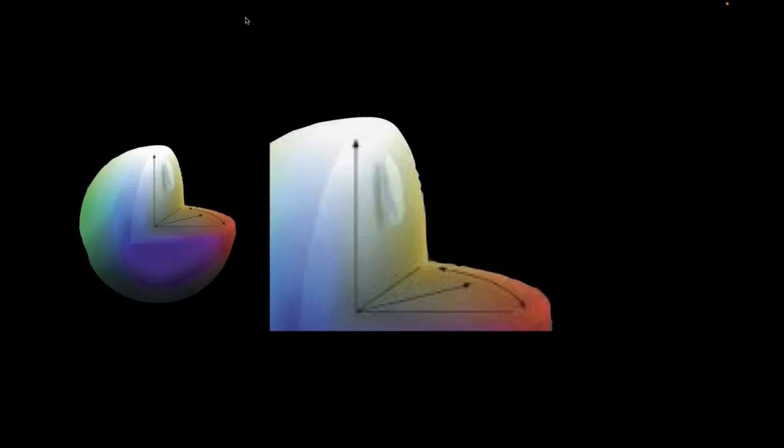The reason for that is because of how we see color. And what I mean by that is the world of color, or the color space that we work in, is a vast amount of colors and saturations. But if you look up in that little top corner, that little circle that you see there in color, that is dental color. That little space that's up in the upper right-hand corner there, that's where all the dental color exists.